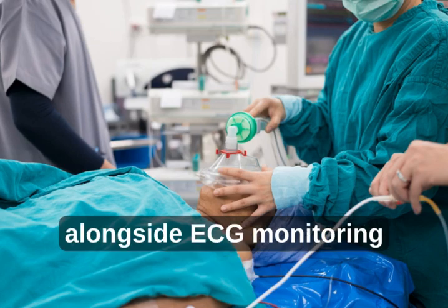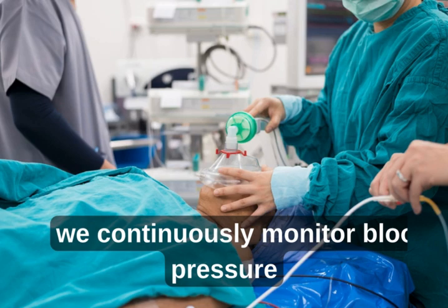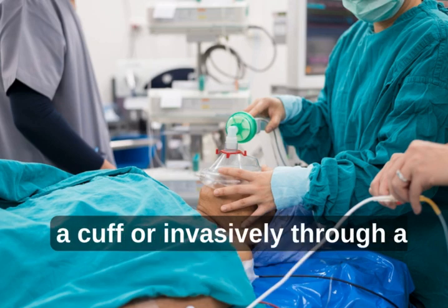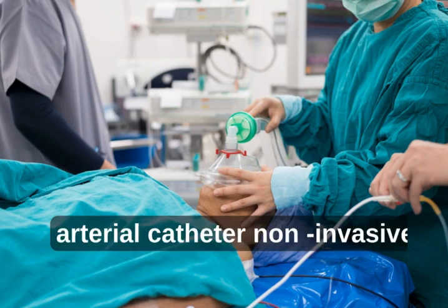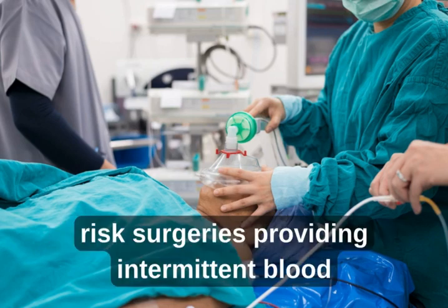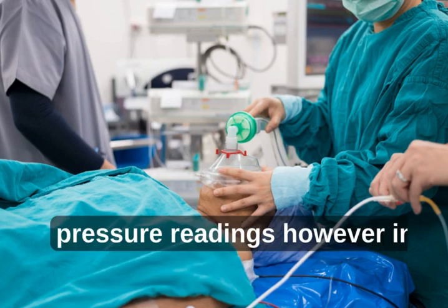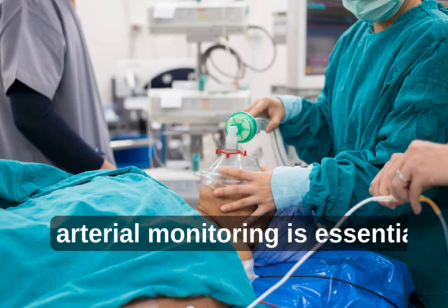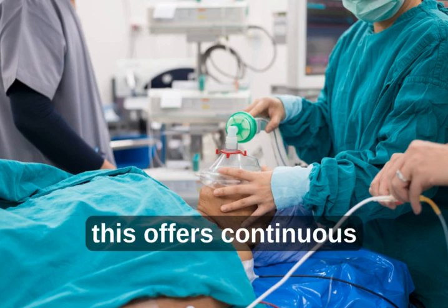Alongside ECG monitoring, we continuously monitor blood pressure, which can be measured non-invasively with a cuff or invasively through an arterial catheter. Non-invasive monitoring is commonly used in lower-risk surgeries, providing intermittent blood pressure readings. However, in more complex or high-risk procedures, invasive arterial monitoring is essential.